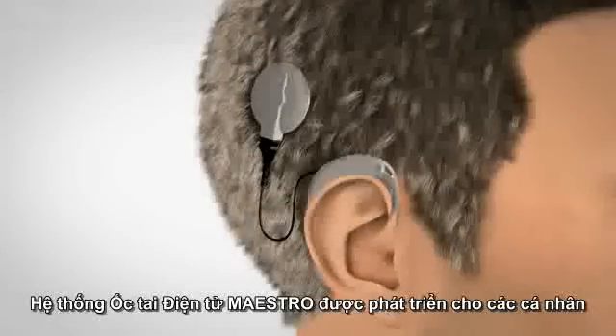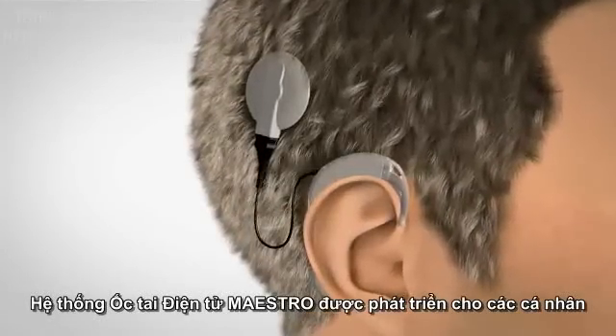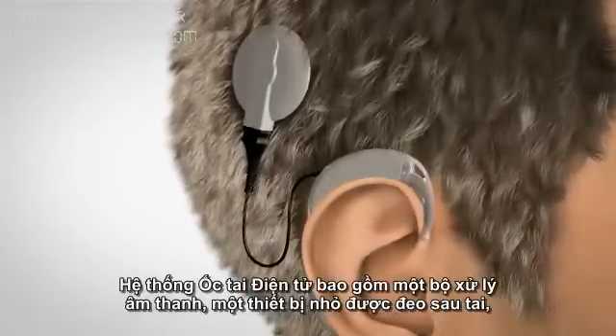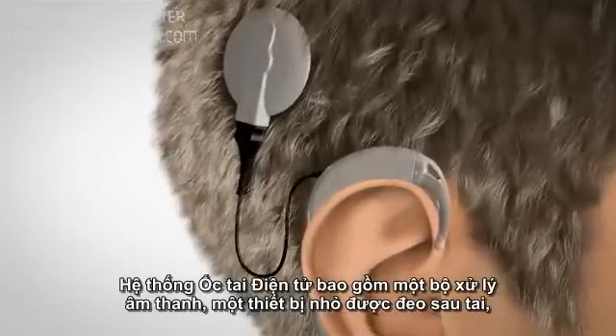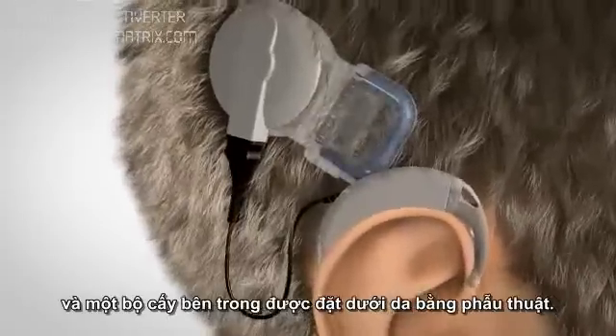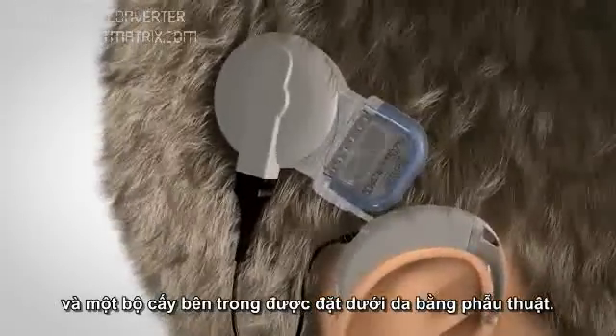The Maestro Cochlear Implant System was developed for individuals with severe to profound sensorineural hearing loss. The Maestro CI System consists of an audio processor, a small device worn behind the ear, and an implant which is surgically placed under the skin.